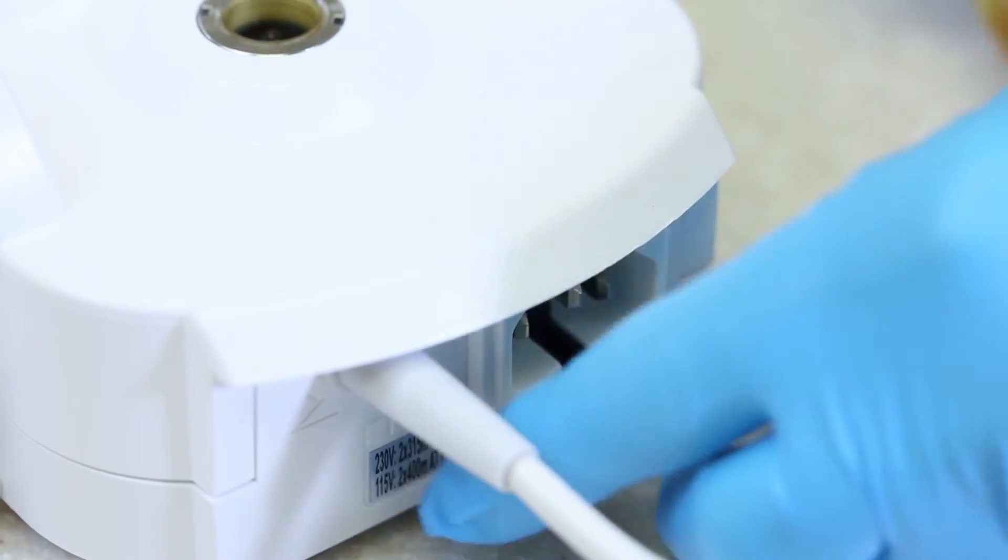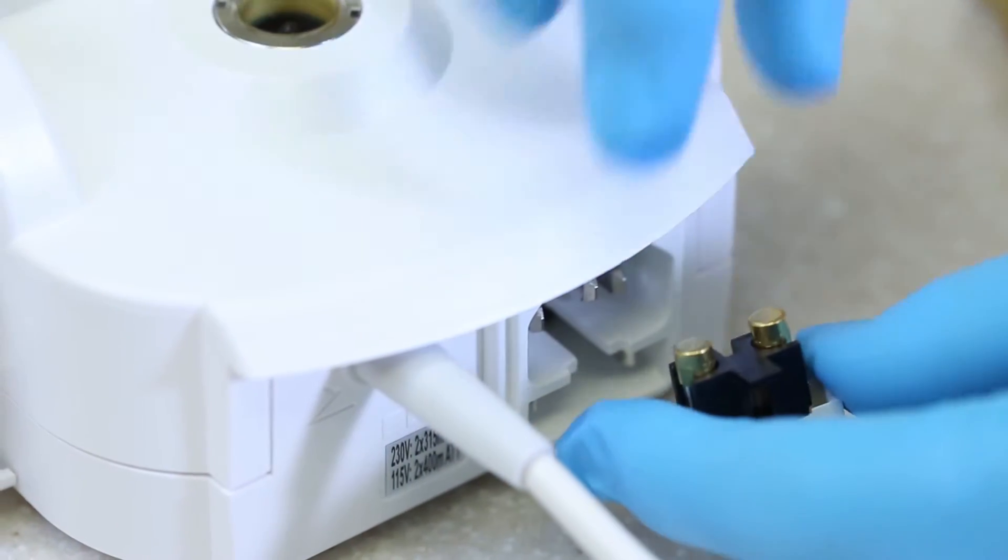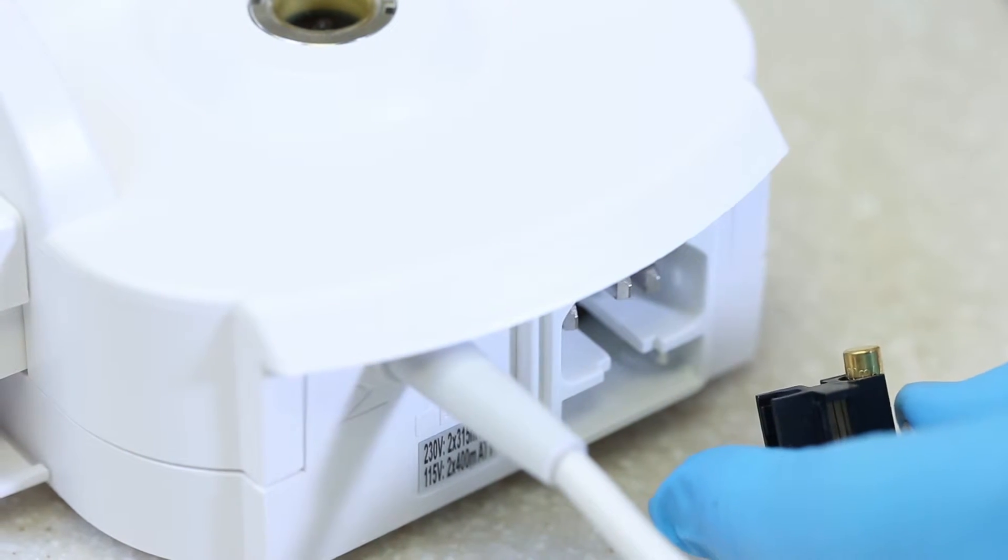To release the fuse holder, using a small flat head screwdriver, push down and out on the plastic clip. This will release the fuse holder.